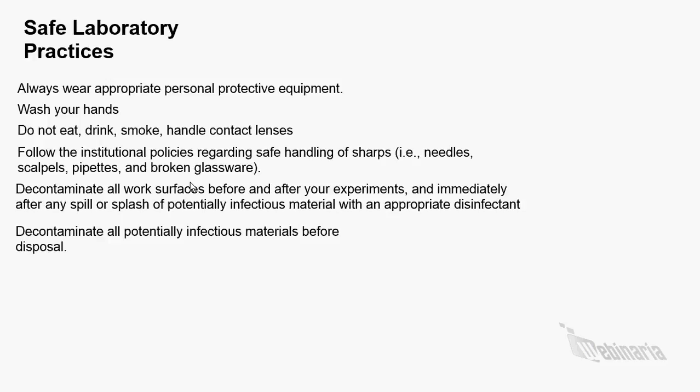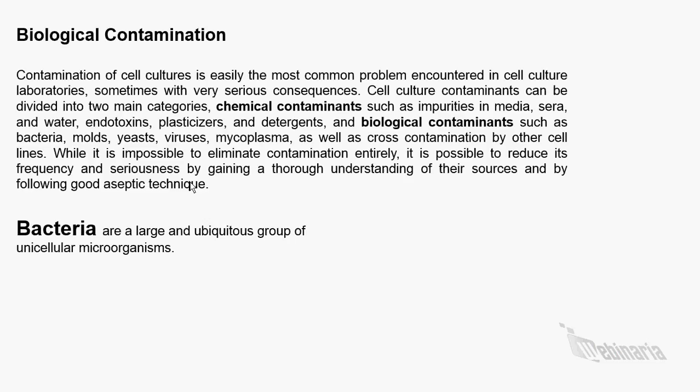Okay, what are the basic biological contaminations in a tissue culture lab? A specific requirement for a cell culture laboratory is to maintain freedom from biological contamination. It's a very, very important part. There are several kinds of contamination that your media or your culture can have. Some biological contaminants are very common, like bacteria, molds, yeast, viruses, mycoplasmas, as well as cross-contamination by other cell lines.